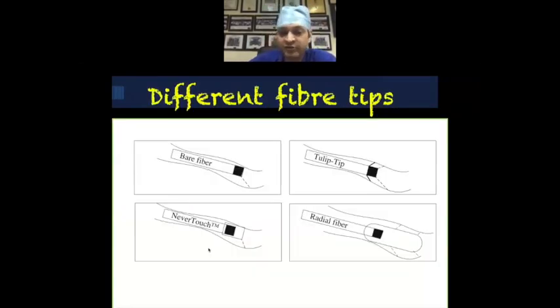So look into this. This is a very important slide. If you look into the bare fiber, look into the slide, how the laser energy is delivered. The whole energy, the higher energy, was delivered here. It used to perforate the veins.